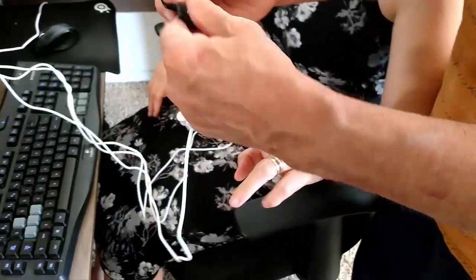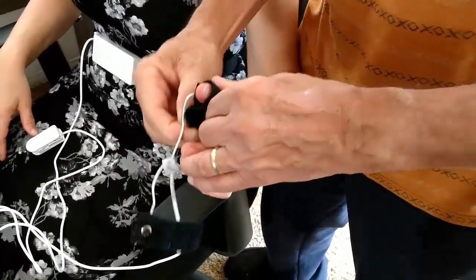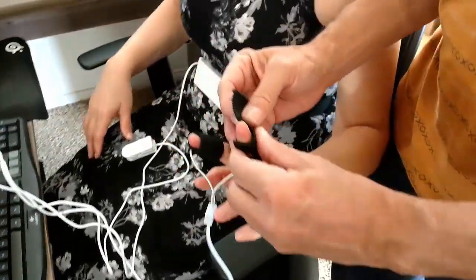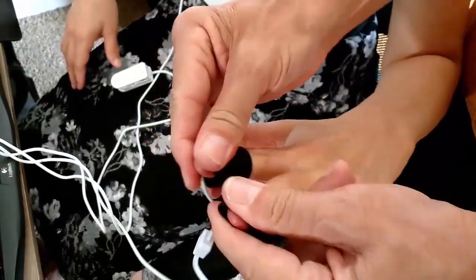And then I'm going to put this around her, oops, it really should be on the outside. Oh, it is on the outside. Okay. And then we'll put this around her middle finger, like that. Like that. Okay, so now, is that comfortable?